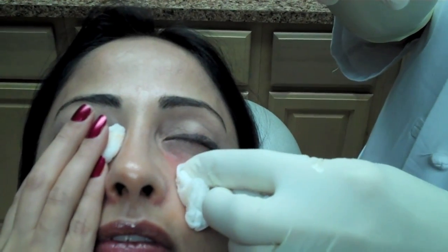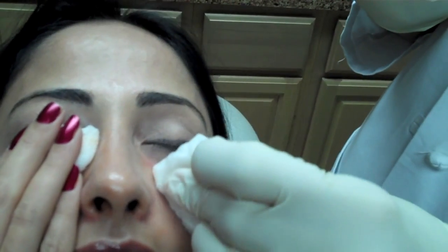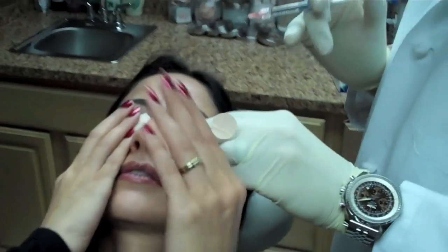That's it. And while bleeding and bruising can be common because the muscle that covers this area is very vascular, it actually is surprisingly not that bad for most people. Now once in a while people will bleed and bruise significantly, almost like surgery, but most patients just get a little bit of yellowness or green hue of a bruise. Nothing too terrible. Okay. I'm going to have you hold this pressure here for a second. Good.